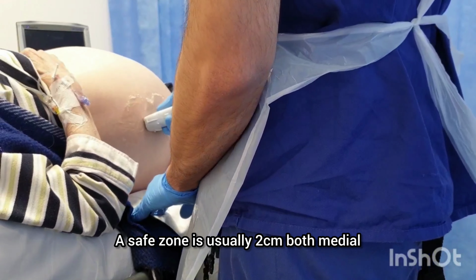With your dominant hand on the proximal part of the drain, you will twist, thrust, and drive the drain forwards through the layers of the abdomen. You will feel some give as you breach the parietal peritoneum and enter into the peritoneal space. You will confirm this by aspirating fluid through the drain by pulling back on the attached 20 ml syringe.